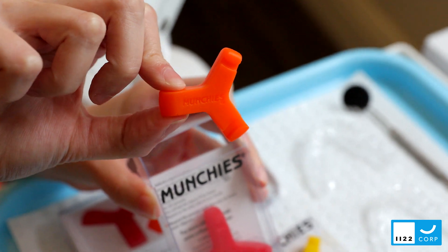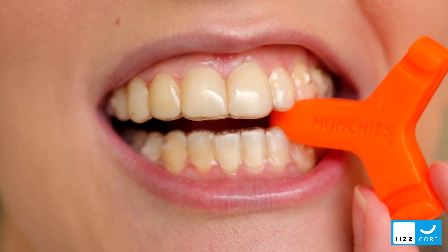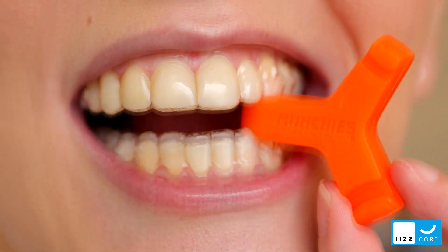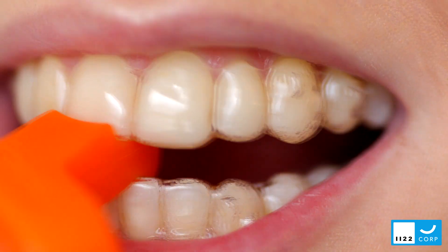Our aligner changeover packs feature an orange device from the Munchies Firm range and a larger red device from the Munchies Max range, and are best used when changing over to a new set of aligners.